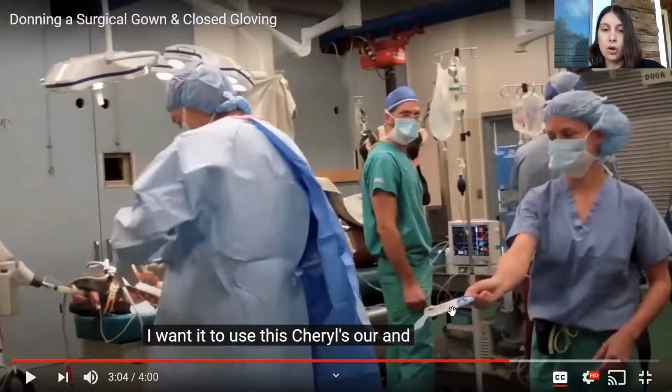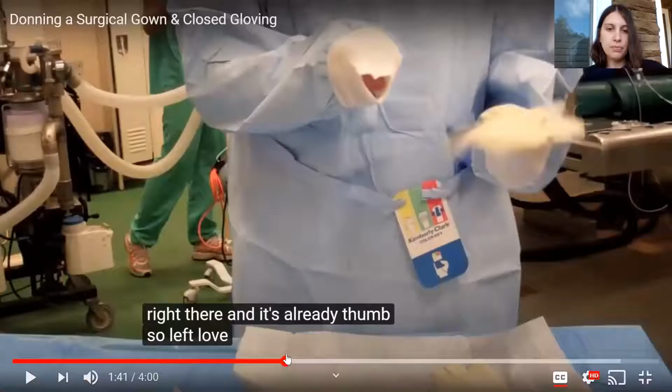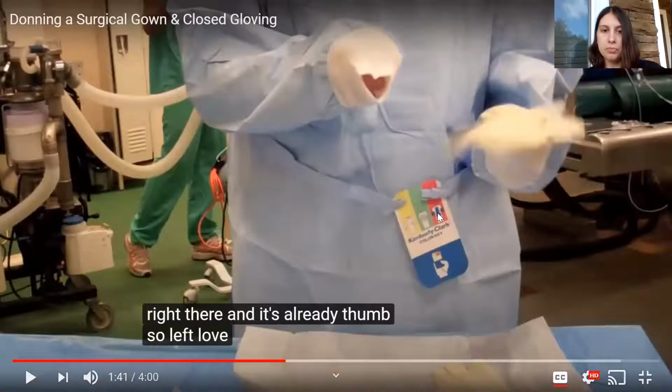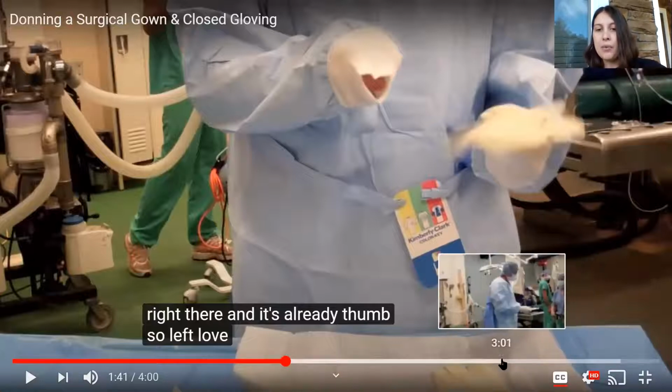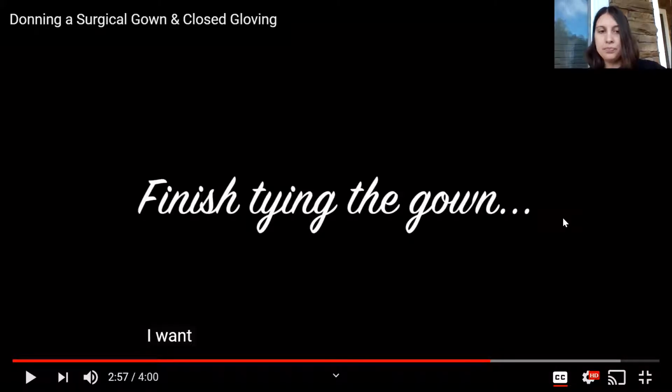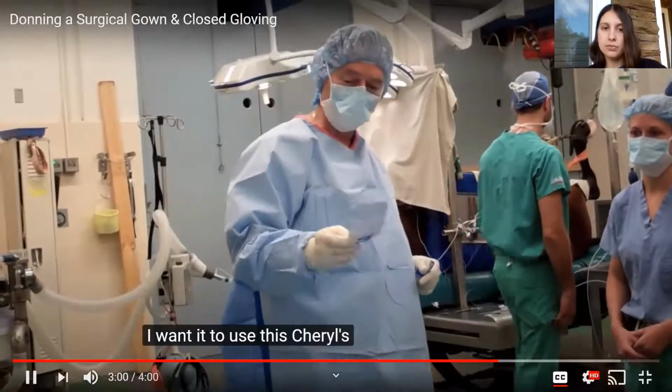So this sterile card was also there when he was putting on the gloves; this is that same sterile card. When he initially put on the gown, the ties are already like that with the sterile part up there. It got sterilized with the gown pack so that when it's time to put it on, it's there.